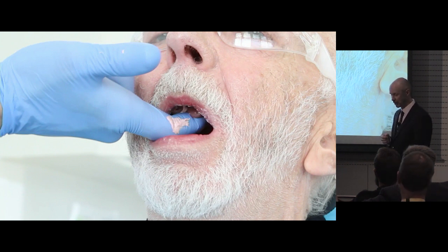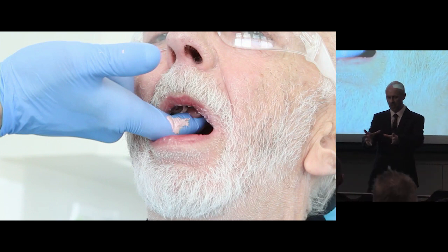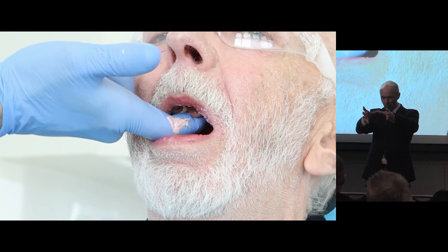So basically what I'm trying to do is essentially do the impression with the patient doing all the functional movements that they would do during their everyday life. So it's not going to dislodge, but maintain a seal as best as possible.